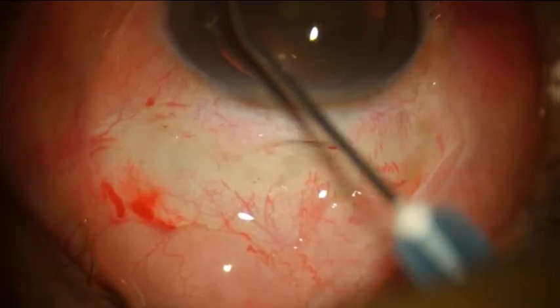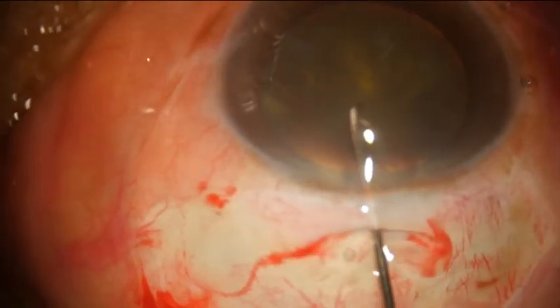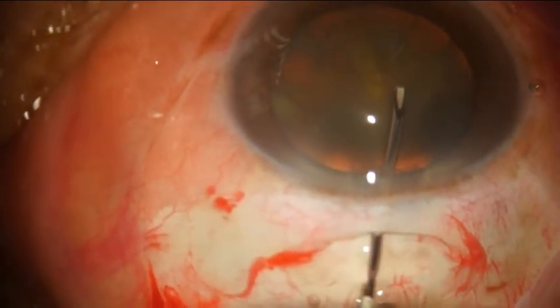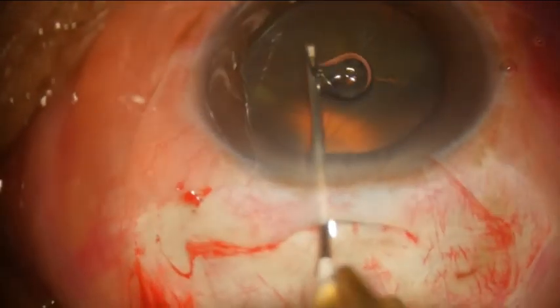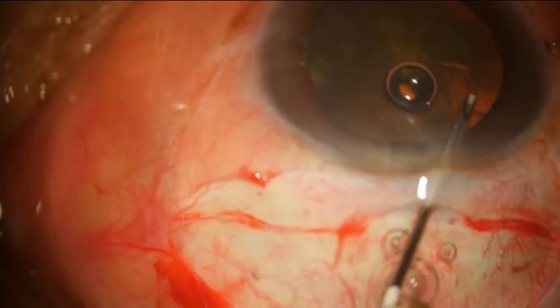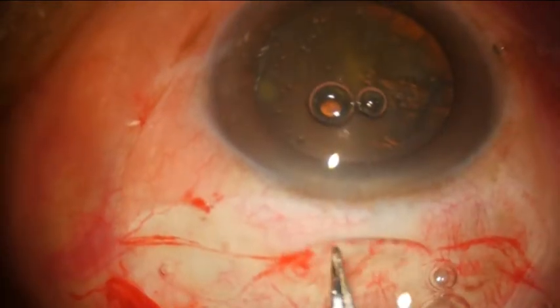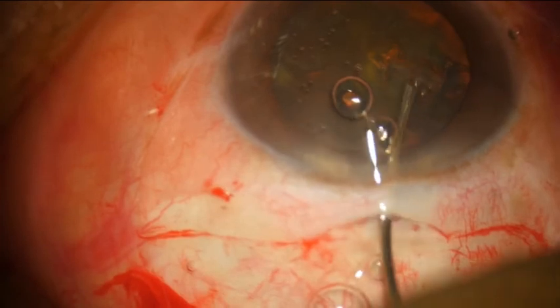Visco is spread onto the cornea so that the assistant doesn't have to continuously wet the cornea, and some amount is put into the eye. A bent 26 gauge needle is used to make a circular capsulorhexis in the usual way — everyone has their own preference; you can use forceps, but I prefer a bent 26 gauge. The circular capsule is then removed with the forceps.